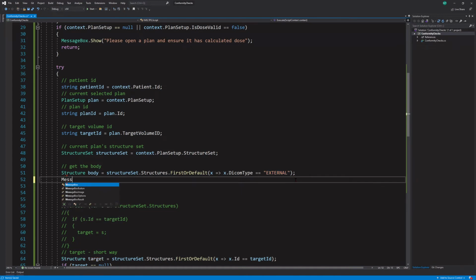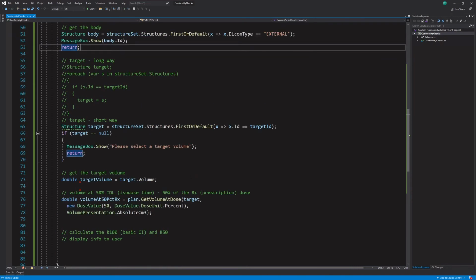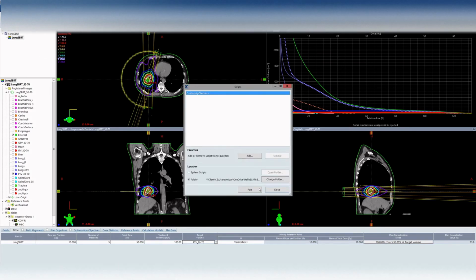So let's just test it. Let's say message box dot show body dot ID. And let's just see if it crashes. We won't return. We'll just test it and then see if it works. Okay. Let's see. Run. External. So it did get it. Okay, good. All right. So sometimes you need to test things.